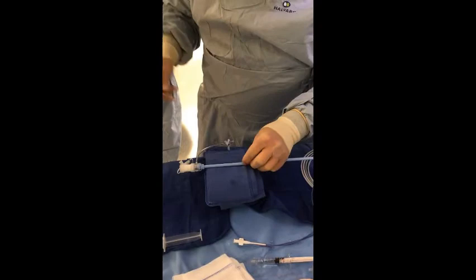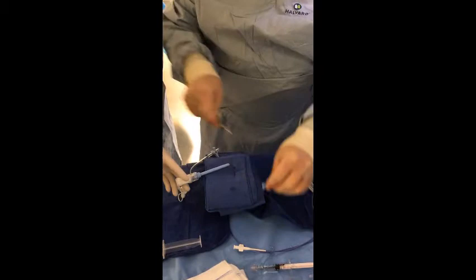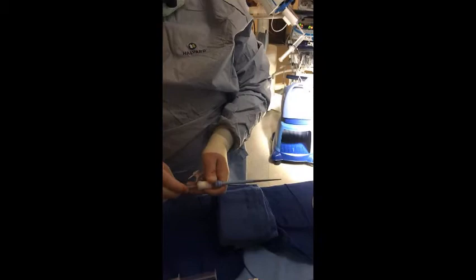We modify the delivery sheath by cutting it with a knife to shorten it. In the case of a self-expanding valve, as we are using in this case, we use a Gore Dry Seal sheath. You can do the same to an Edwards E-sheath.